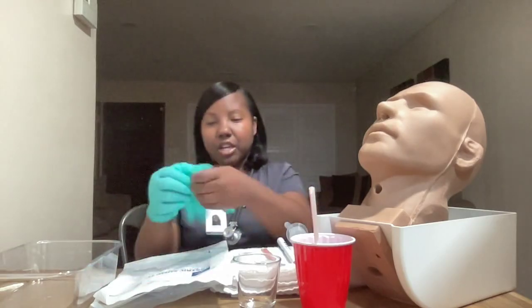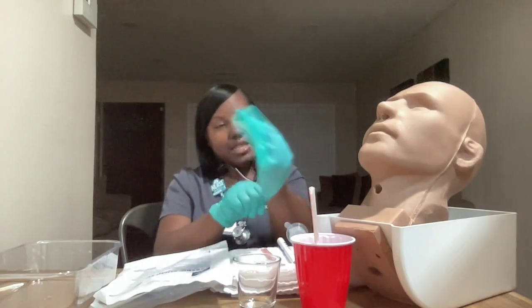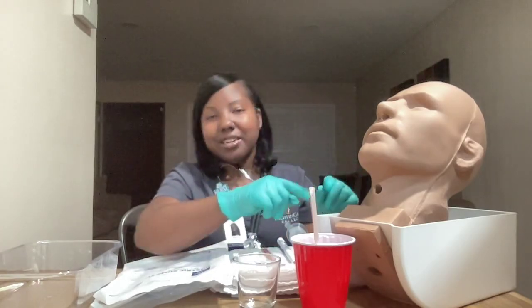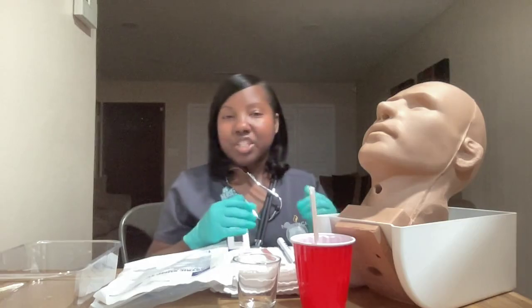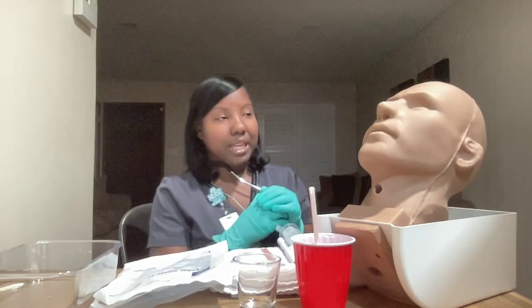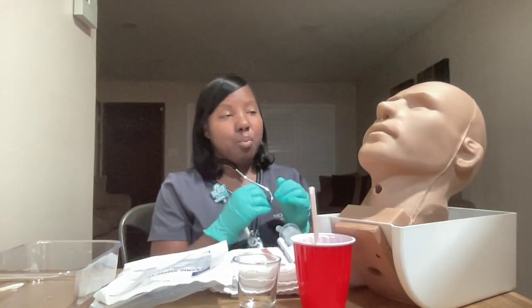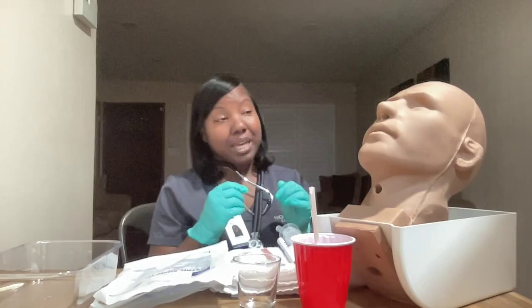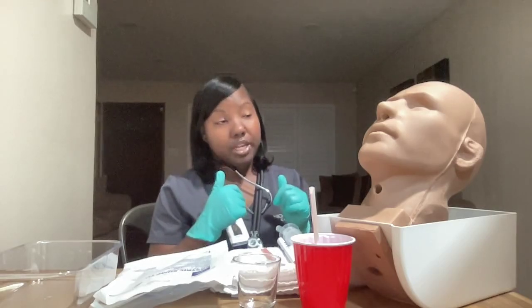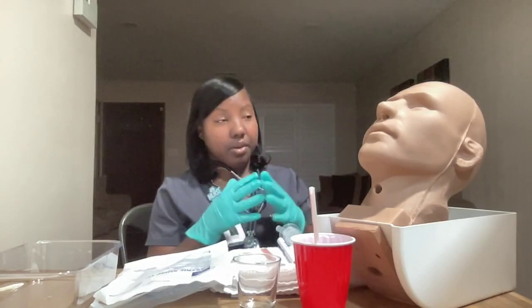Hello, my name is Michelle. I'll be your nurse today. Can you please tell me your first and last name and your date of birth? Thank you, Ms. Jones. I verified that information against her wristband. Ms. Jones, today your doctor has ordered the placement of an NG tube for suction — a tube placed through your nose that goes to your stomach to collect gastric contents and clean out your stomach.